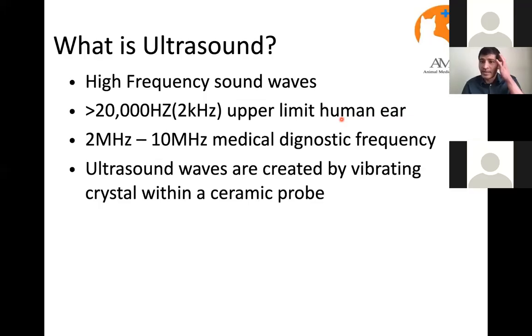I hope by now everyone is a little bit aware of the frequency of ultrasound, since I hope we are all recent graduates or final year students here today. The ultrasound is generated by the probe that we use, and it travels through the object, then we get the image.